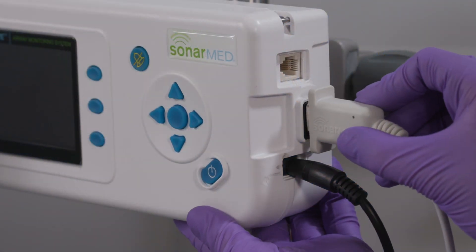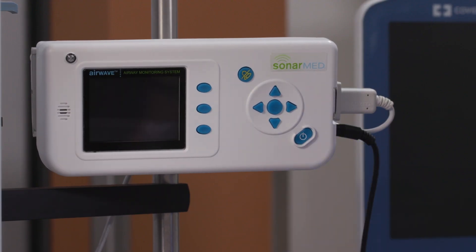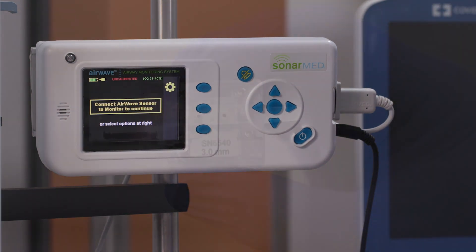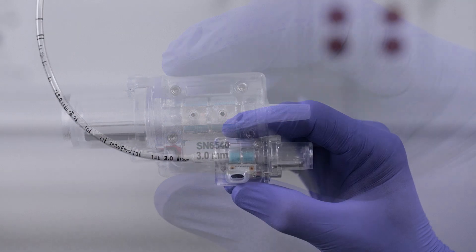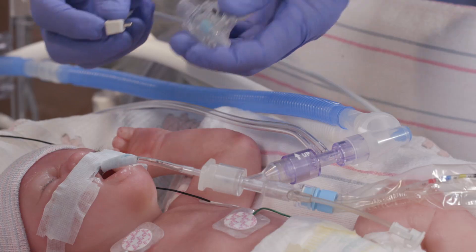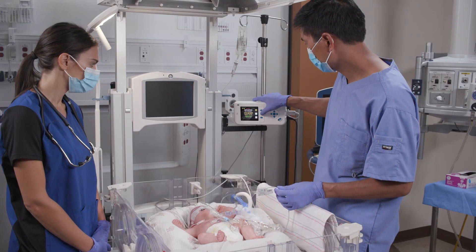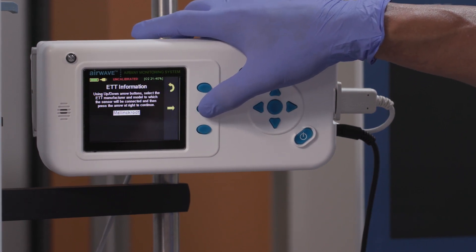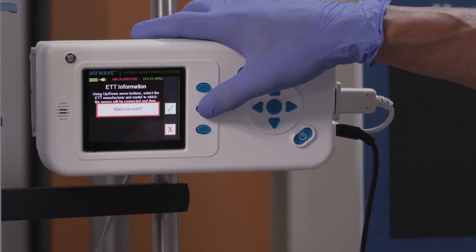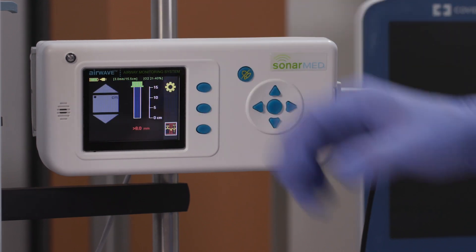We are now ready to set up and connect the SonarMed device. Turn on the monitor — it will emit an audible tone. Choose the appropriate size sensor to match your patient's ETT size, then connect the sensor cable to the sensor. Step-by-step, the system will walk you through a short setup process.